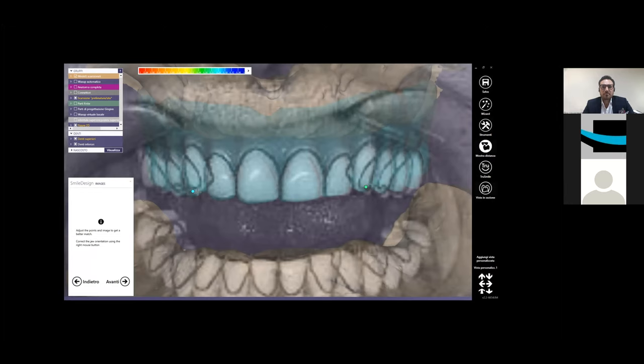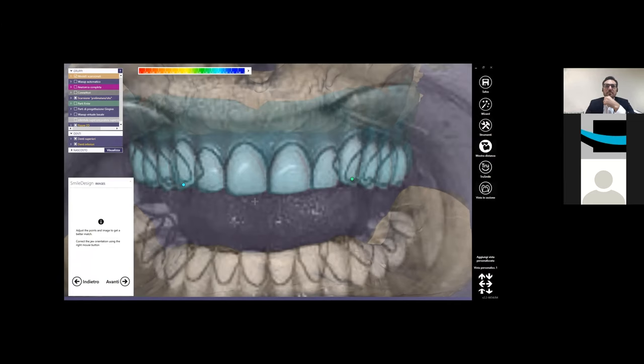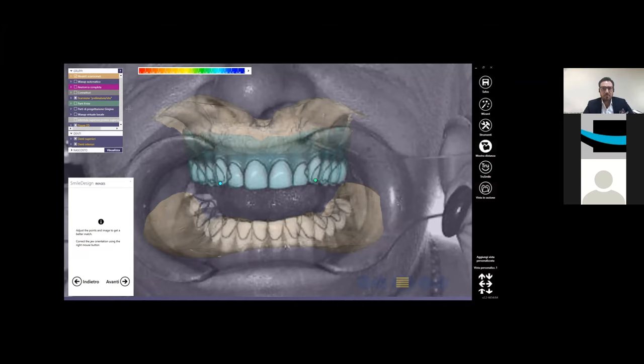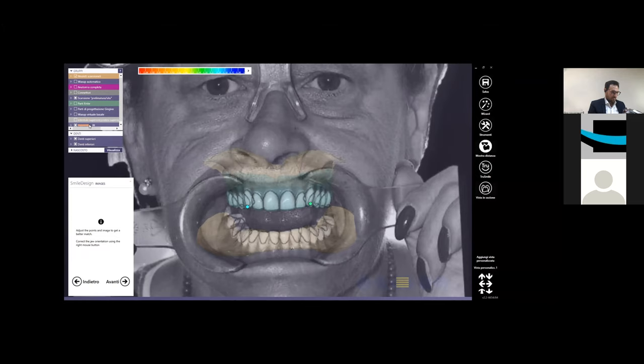So this is very important. You can do that in the perfect way. As Luca Lavorgna said before, we have the right measure. It is true, because we can measure the face of the patient, and we can do that because we use the glasses on the head, and we have our workflow. We studied this workflow many times in many patients in different publications. So we want to share this workflow, because it can provide the real measure and the real superimposition of the face of the patient and the STL of the mouth.